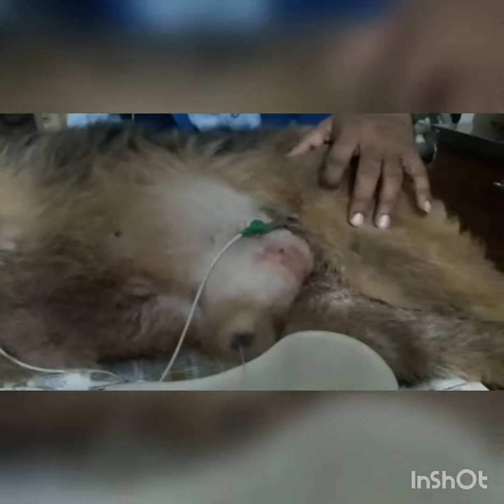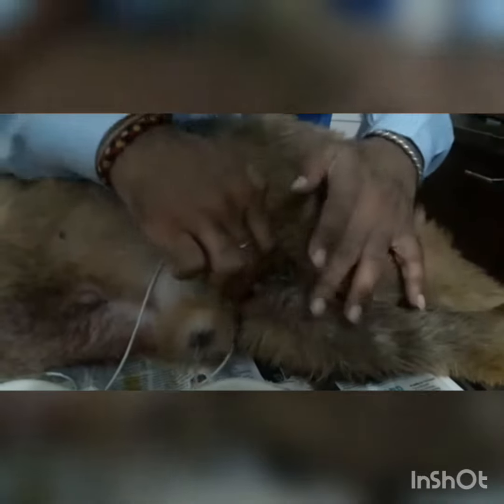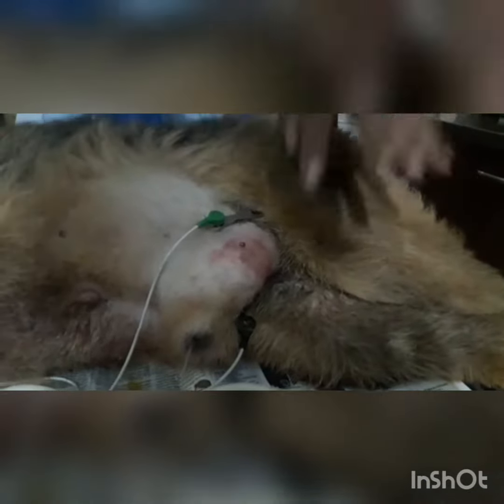Now in the hind leg, I have applied this green clip with the help of gel and spirit for better contact. And this is the black clip which I have applied in the right hind leg.